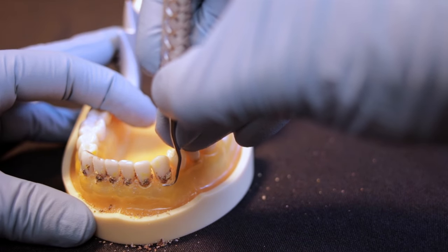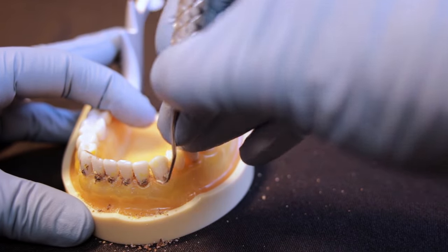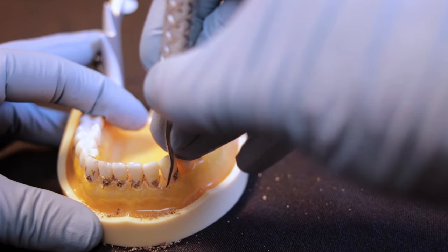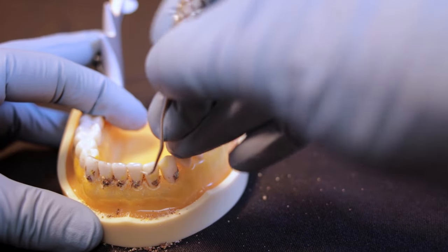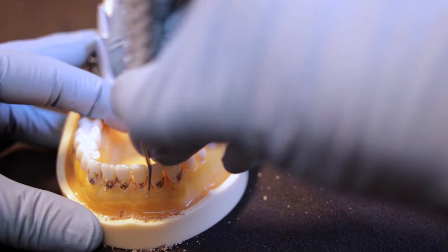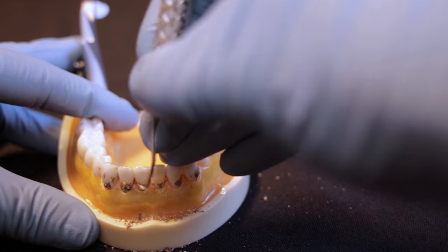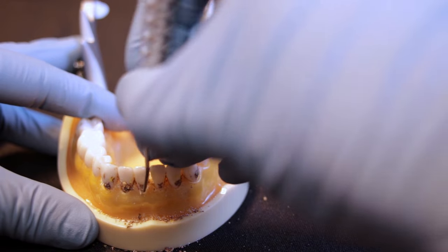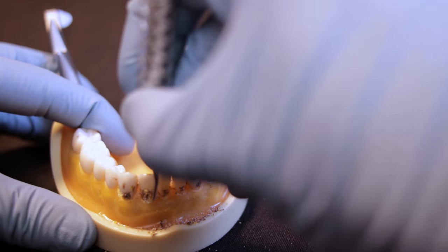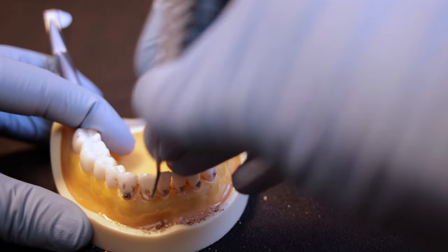Now that we've finished the interproximal, I'm going to start getting the straight facial and straight lingual surfaces. I'm still going to cut the tooth in half and I'm now using an area-specific curette, which is a Gracie 1-2. It has a nice rounded toe and I'm able to go sub-gingival, so when scaling calculus like this you go sub-gingival underneath the calculus and pull up — going just below the calculus so it comes off a lot easier. I'm also rolling interproximally just to make sure I've fully covered that area, but mainly focusing on the straight facial.